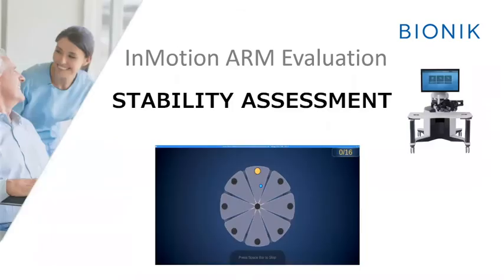The next part of the report is the stability assessment. This examines the patient's ability to maintain a position in space, in this case, the center point of the circle. This is against a force that's being applied by the robot into specific directions that correspond to muscle groups.